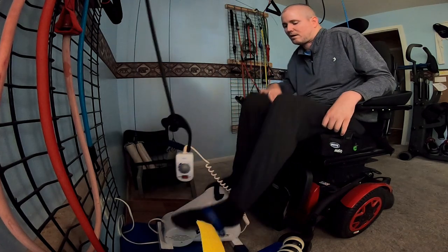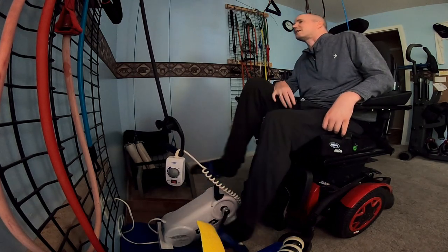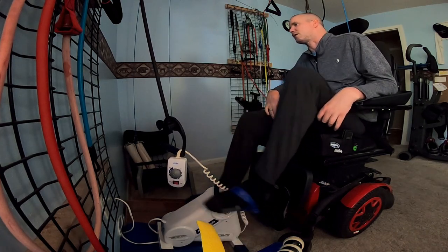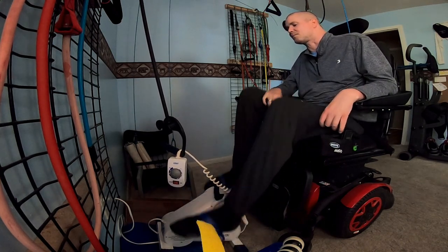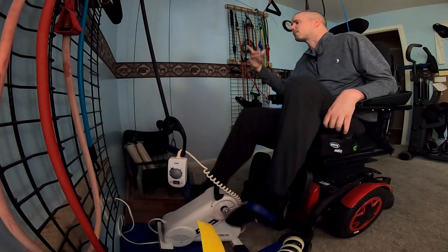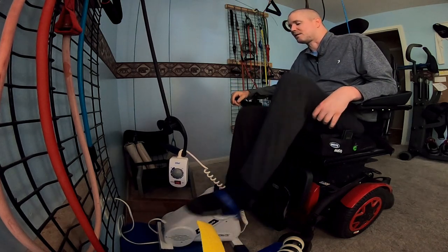Then I let this sit like this, and just... I usually have the music playing. Kind of boring if it's just quiet and you're just sitting here letting your legs pedal. And do I try to help? Sometimes yes, sometimes I just let it. But if you can't move your legs at all, this will move your legs in a bicycle motion.